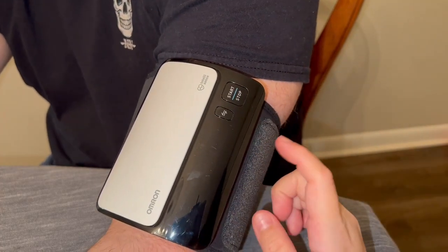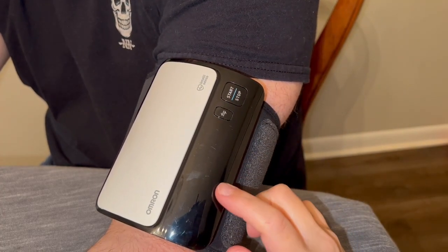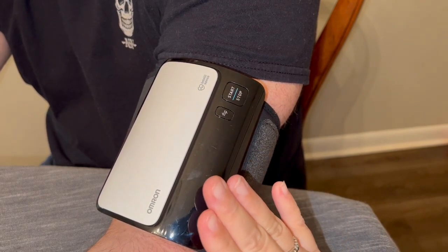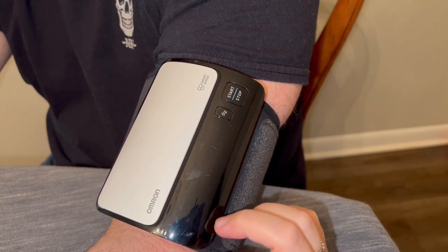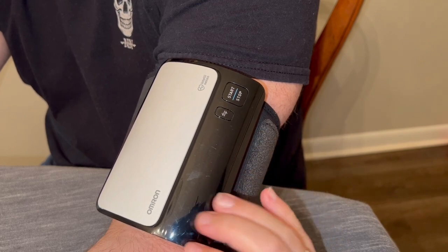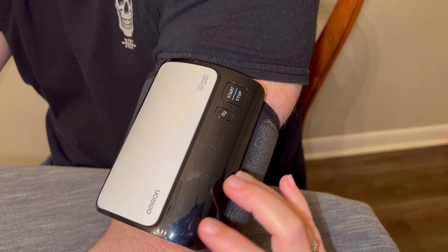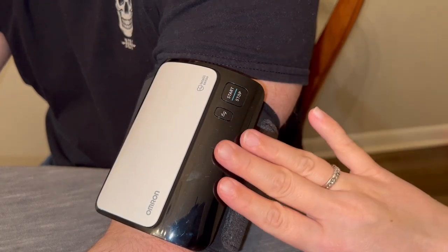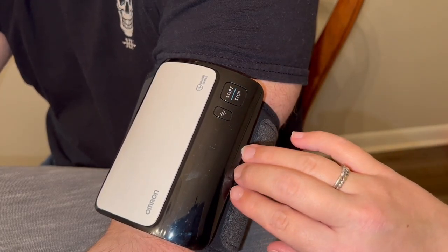Hey everyone, here we have the Omron Evolve Bluetooth Wireless Upper Arm Blood Pressure Monitor. We've had this thing for at least five years, and it's lasted really well for us. My husband has high blood pressure, so we got this because it actually syncs with your phone in the app, which I will show you here in a little bit.